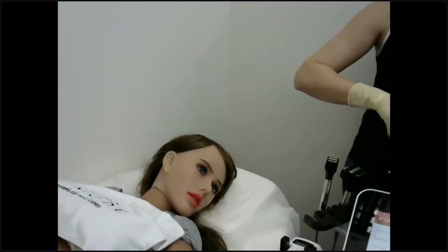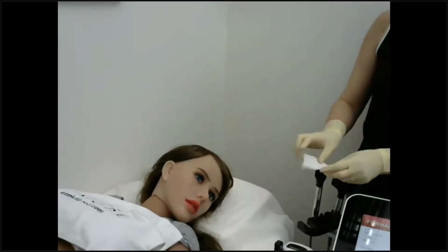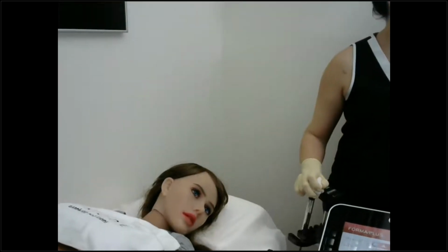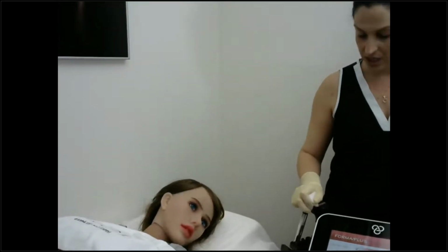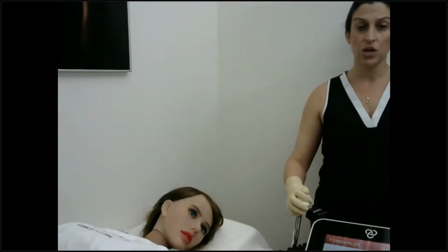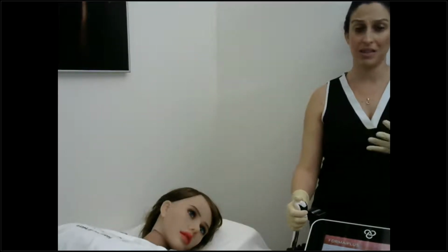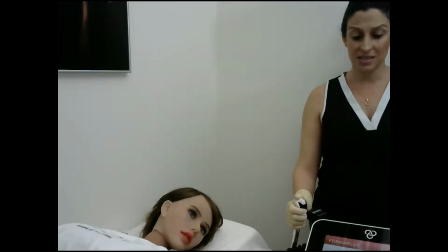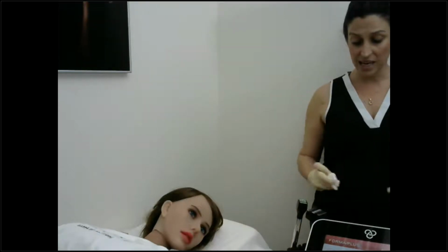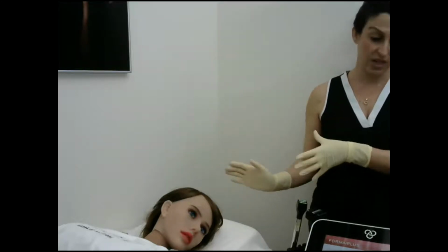Normally, when working on body areas, I would want to mark the treatment zone on a standing patient. The reason is that normally people are walking around standing, so when they're not happy about something in their body, it's when they're standing up. They show me what is wrong or what disturbs them, and I can target it when standing up, and then I make my adjustment on my patient when they're lying down.